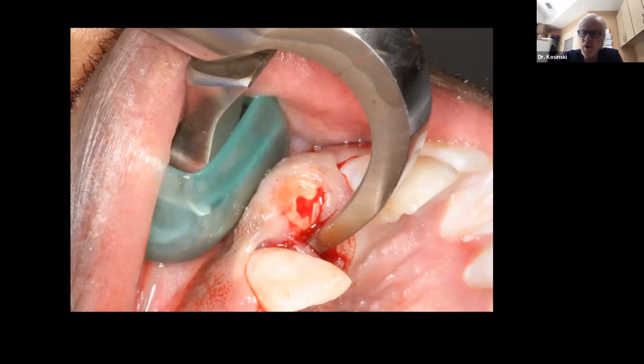It has two components. A beak, which is a shovel-shaped edge, which will engage the palatal lingual aspect of the tooth 1 to 3 millimeters subgingival. And then the bumper is not the working end of the instrument. It is not holding the facial plate. It is placed as high up the vestibule as possible and simply acts as a center of rotation or a fulcrum. The instrument is never squeezed. Rather, we're simply rotating our wrists, creating tension on the palatal aspect of this tooth.